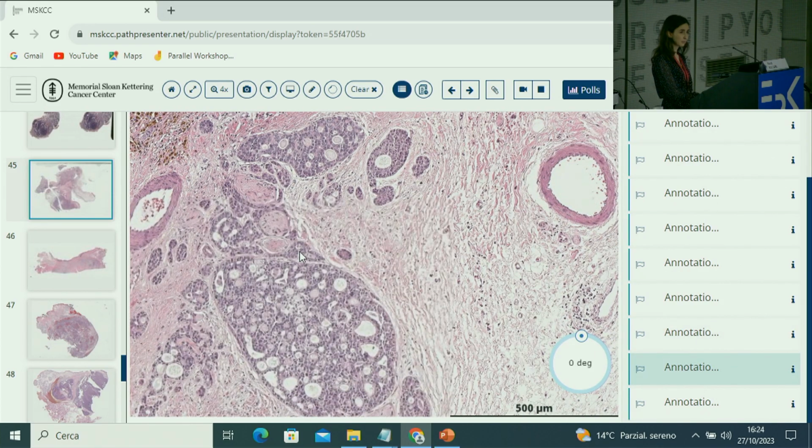What do you think? Yeah, this is a real adenoid cystic carcinoma with high-grade transformation. That's why initially this phenomenon was called dedifferentiation, because it can really go even to sarcomatoid. To me, finding a typical morphology can explain the heterogeneity. So that's how I explain things.